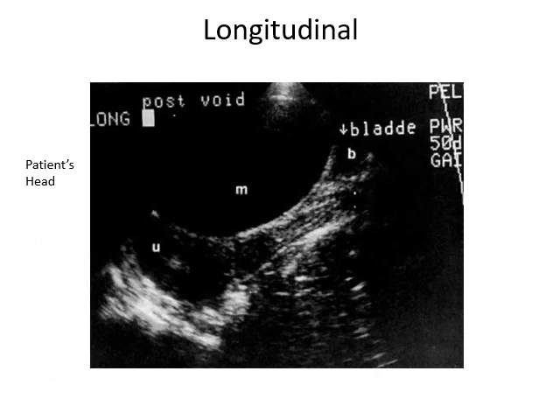So the person was laying in this direction when they were getting this ultrasound done. What you're looking at in this direction is deep down into where their bladder is. So you're looking down through their body into the bladder while they're laying in this direction. So obviously their feet are on here.